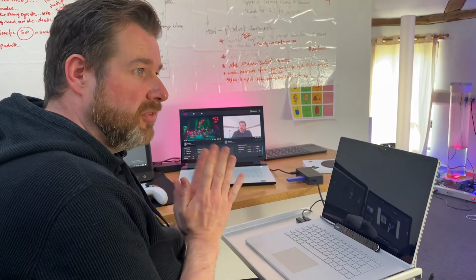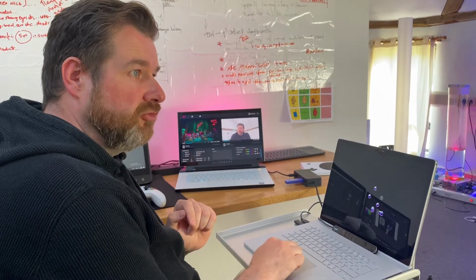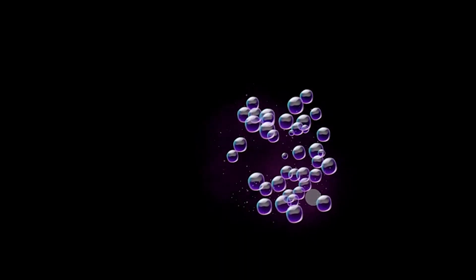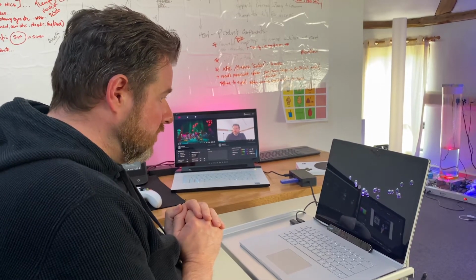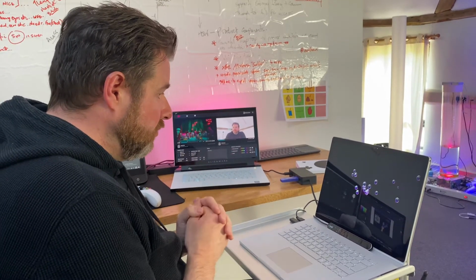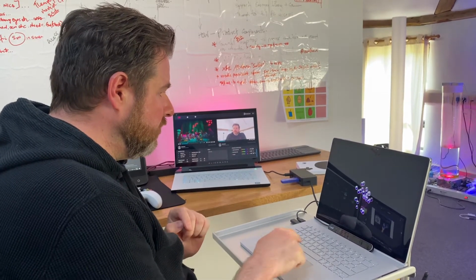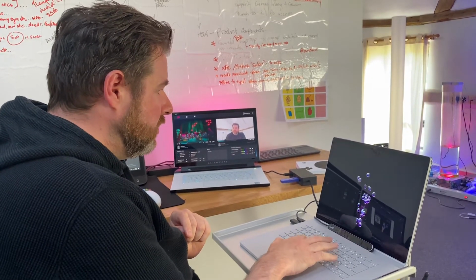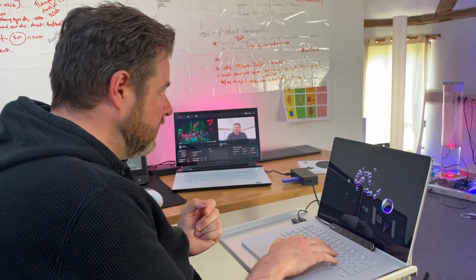So to begin with, we have an app running. Nothing's going on. If I move a mouse, it will generate some bubbles stimulating the screen, at which point that might arouse my attention to look at it. And when I do so, now I'm generating the content with my eyes. Now, what we can do here is press B on the keyboard to add an object in. So obviously I'm responding to that immediately.